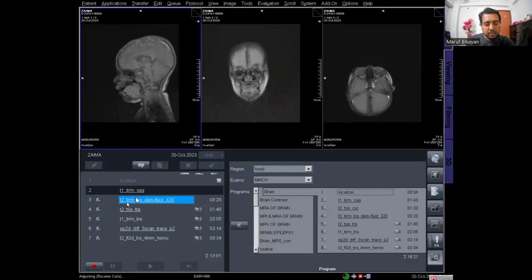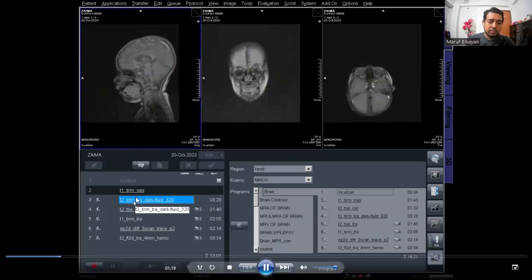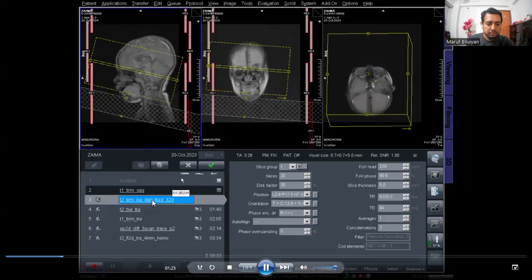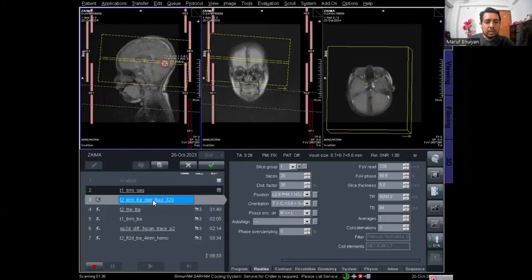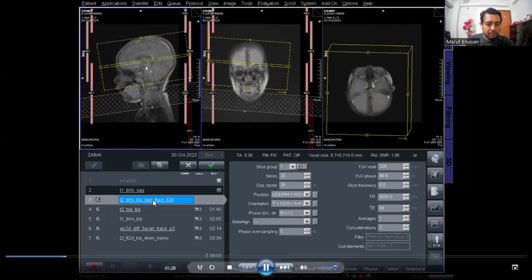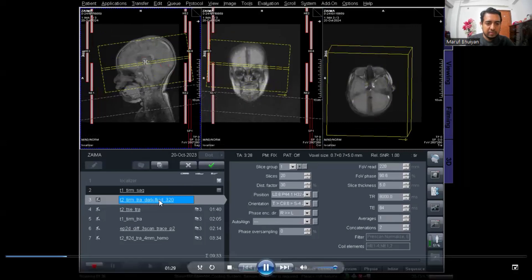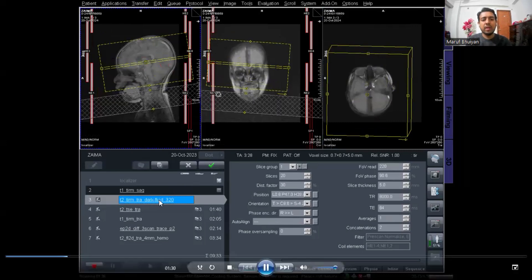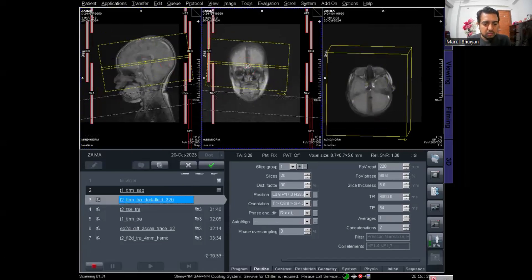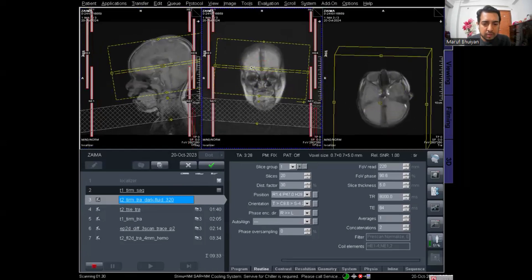I am deleting the T2 coronal and opening the T2 axial transverse, then planning the axial FLAIR or dark fluid protocol for the transverse images.